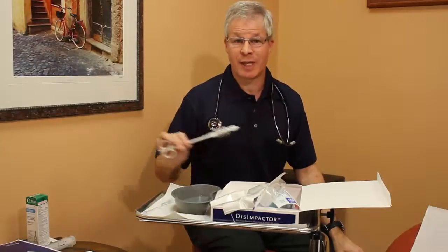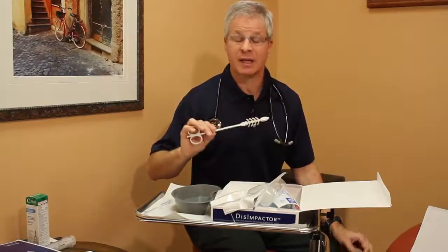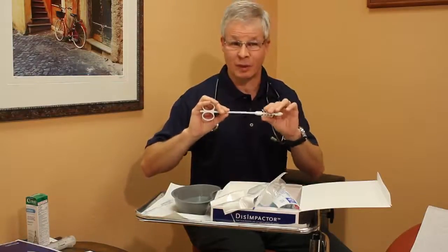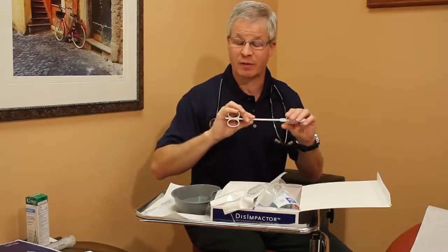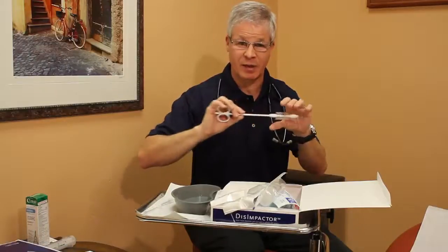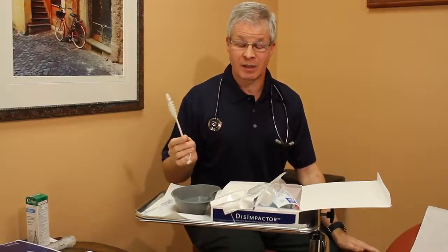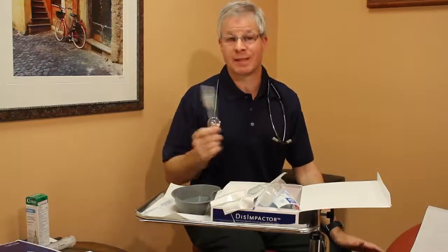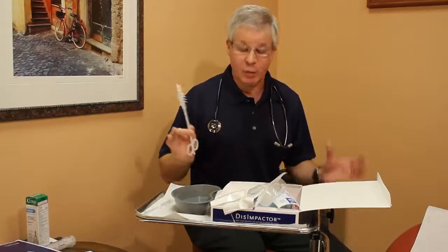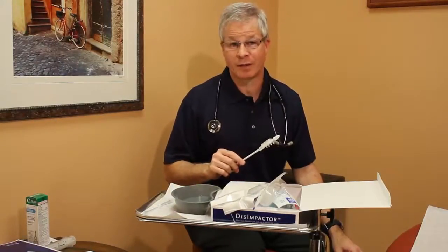So what we would do is we now take a second clean DisImpactor and do the same procedure. Again, we're going to ask the patient to just slightly bear down. We're going to insert a well-lubricated device, stay within the fecal load in the long axis, and do the same procedure where now they bear down and the device is withdrawn. We'd again inspect it and discard it and assess the clinical variables. Did that relieve the impaction? Always a chance that it may have, but quite likely the impaction is still there, and that's what gets us to our third and final device.